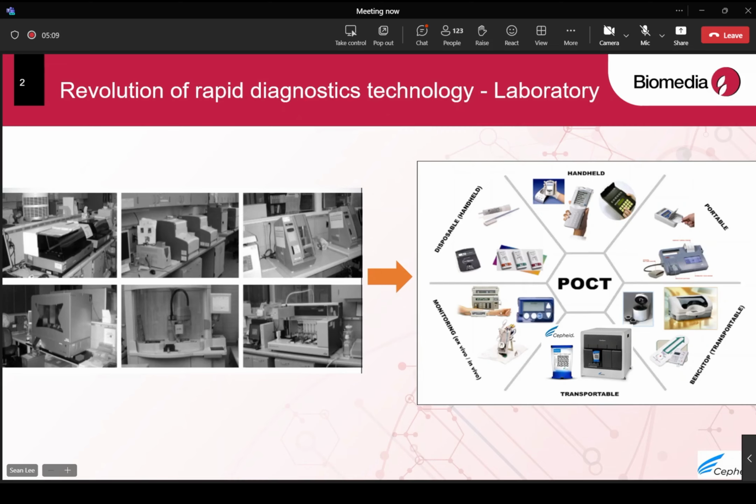As you know, they need to batch the samples before they run PCR tests. You probably get your results in maybe more than 1 month. And of course, not that long. I mean, more than 1 week for sure. Okay. So this becomes an obstacle to do PCR tests.